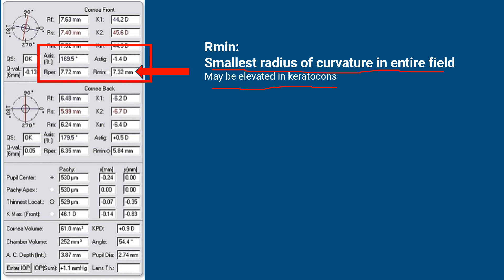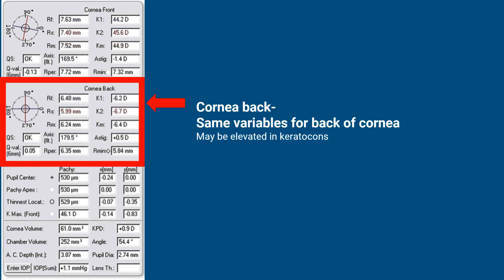Let's go to the next set of parameters — these are the same parameters now from the back of the cornea: K1, K2, Km astigmatism, axis of the flat meridian, R minimum, and RPR. Remember, if the astigmatism here is 6 diopters or more, it is again suspicious. The 6-diopter astigmatism on the anterior or posterior surface is suspicious for keratoconus.